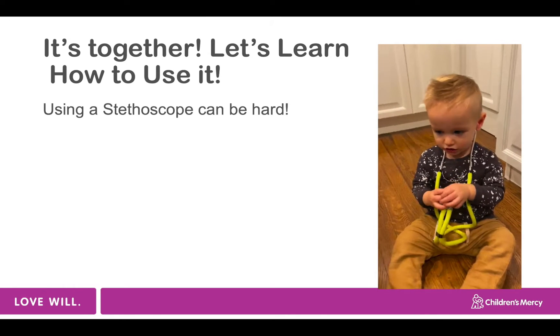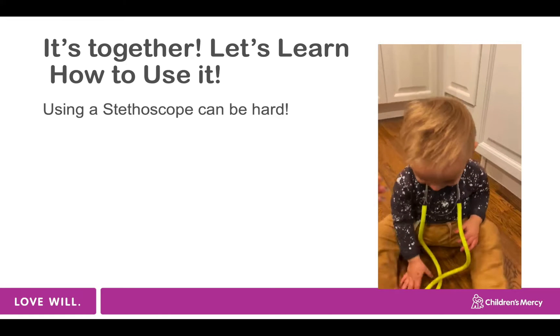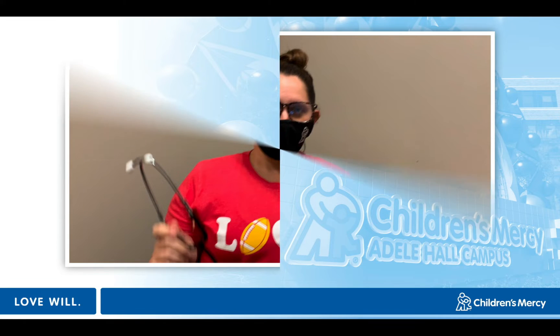We know that using a stethoscope can be hard. This is Levi showing you — it's not that easy, guys. Just stick with us, we'll show you. I want to just talk about the stethoscope really fast.